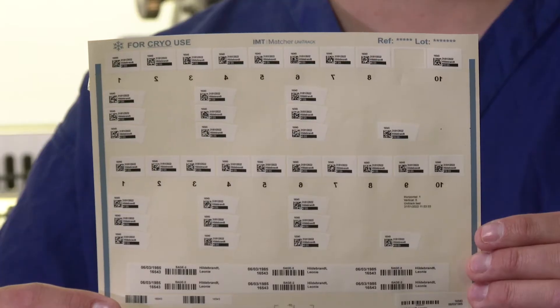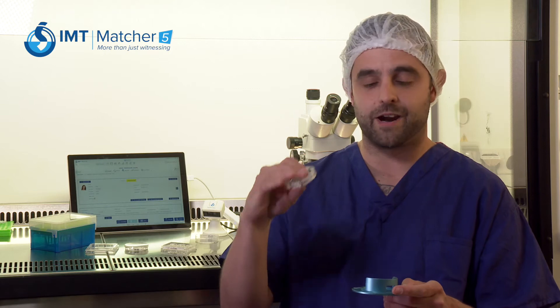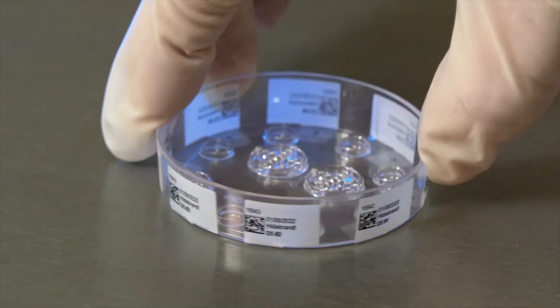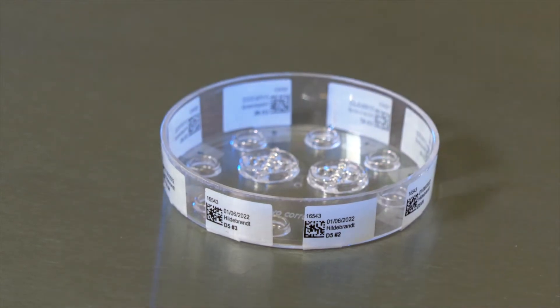Matcher 5.3 has a new label sheet design which can be used for dishes compatible with Matcher's new dish holder called the Active Well Selector. The labels enable 60mm multi-well or micro droplet dishes to be labeled with up to eight unique barcode labels corresponding to the individual embryos in those droplets or wells.